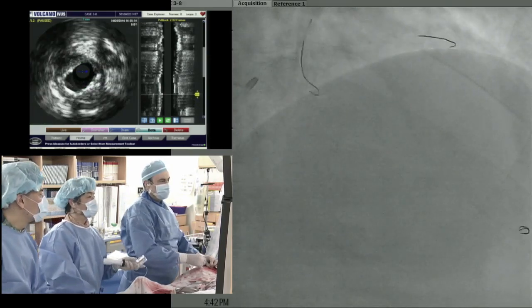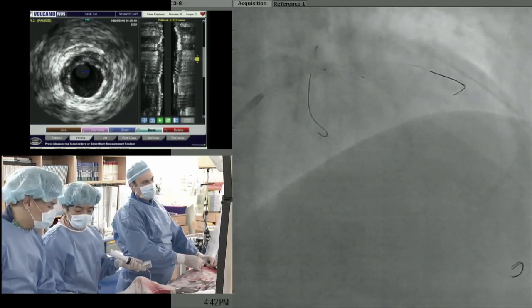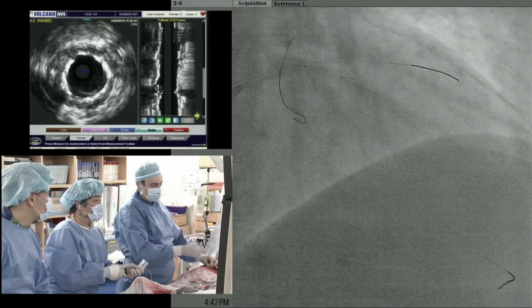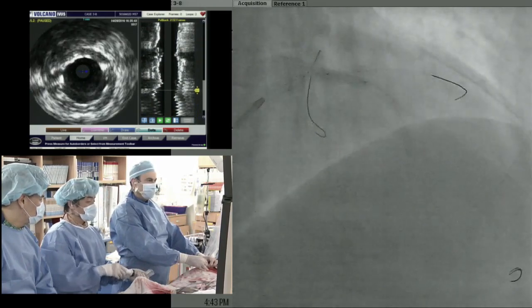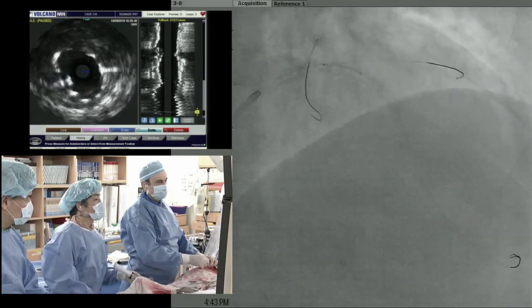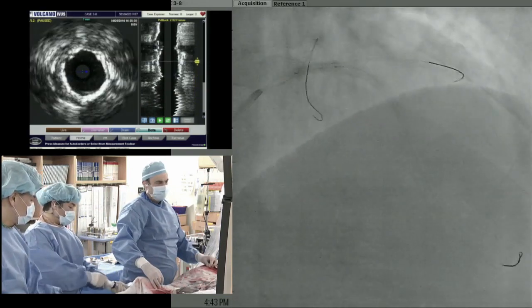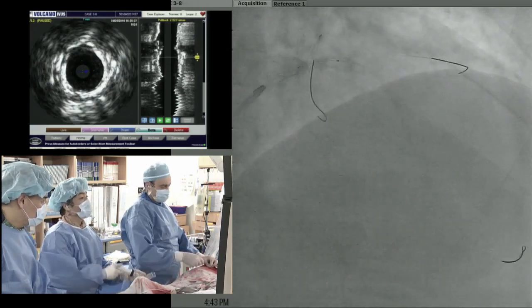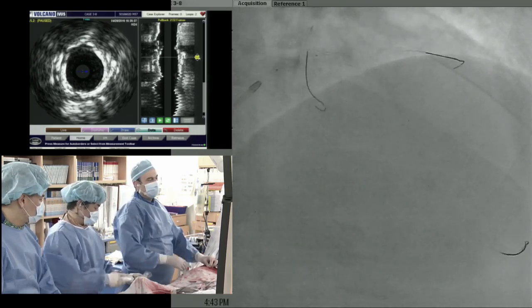Okay, we'll do that. But Gary, I would have one question regarding the crossover from left main to LAD, but you can just see flow to the circumflex is not diminished. However, we can see that downstream circumflex has some borderline lesion. So in the future, if the patient has progression, maybe we need a dilatation through the struts to open the circumflex ostium. Although the FFR should be negative, considering a future procedure in the circumflex, I don't know, is it a good option to open the strut to the circumflex?